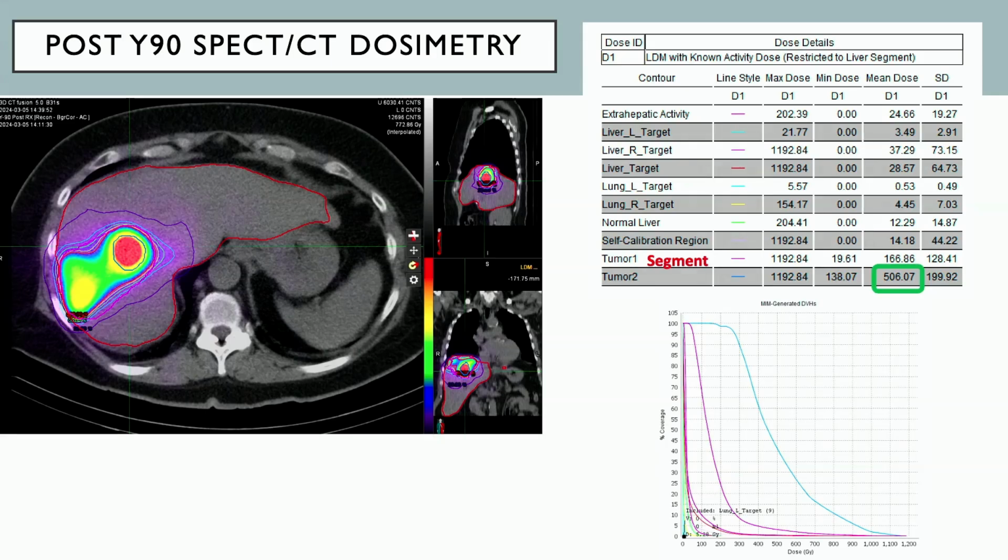And he got a great dose in there, right? I mean, the patient did incredibly well, I imagine. So that's where DVH curves come into play. And that's voxel-based dosimetry. And again, it's a confirmatory thing. We use it to kind of answer questions on the research or academic side.